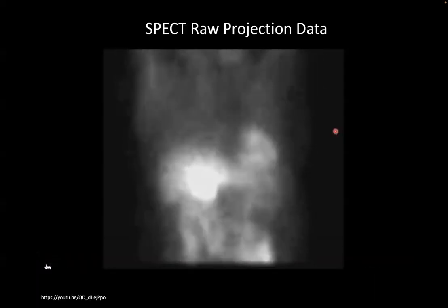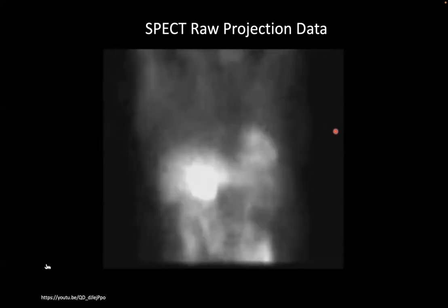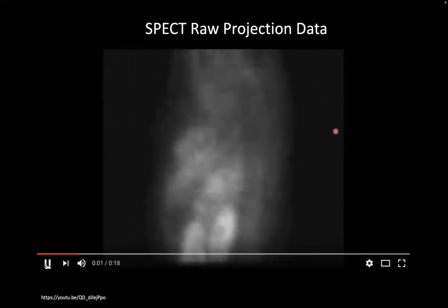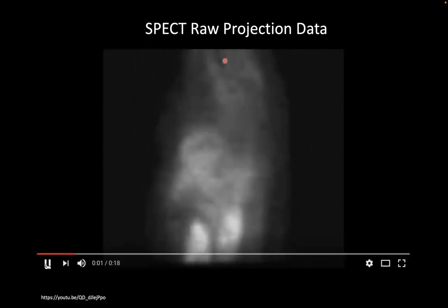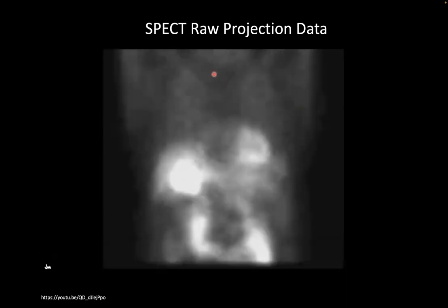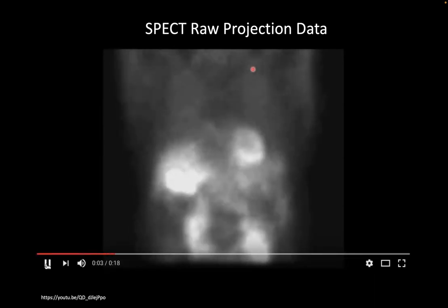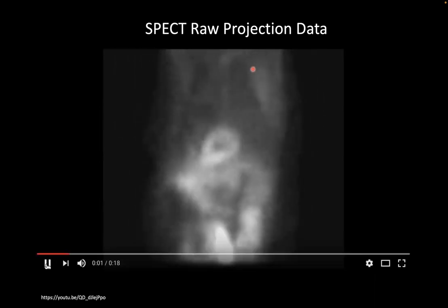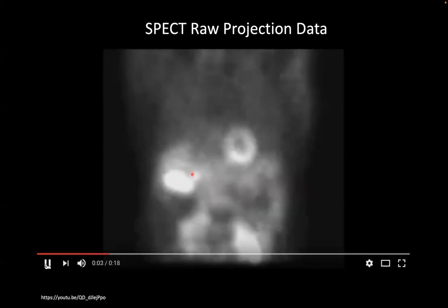This is what it looks like when we look at those two examples I gave you, the pictures of the scanners. Here you have a fairly long detector in the Z direction. This is the patient's head. Well, that's their neck. You can see their neck there, and they have their arms above their head, so they don't get their arms in the way of your imaging. This is the liver here.